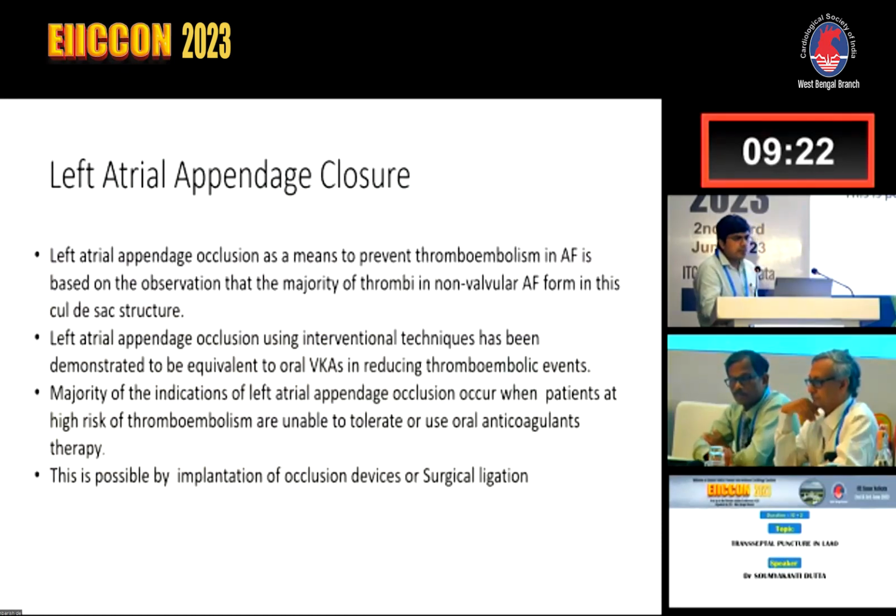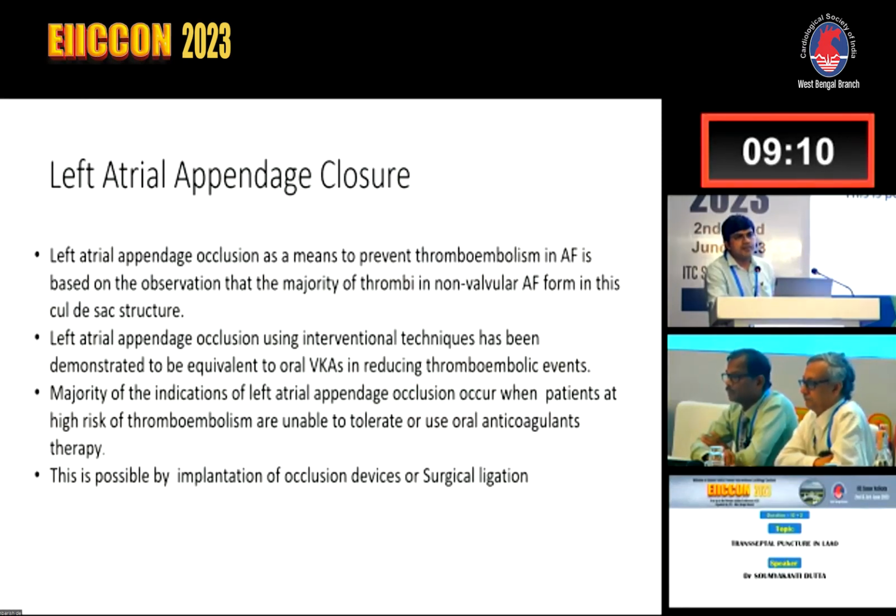So we all know how left atrial appendage occlusion helps us to prevent thromboembolism, because it is the only cul-de-sac that is responsible for thromboembolism, starting from the left atrium to the left atrial appendage. It is the most important structure that generates the clot within the left atrium.